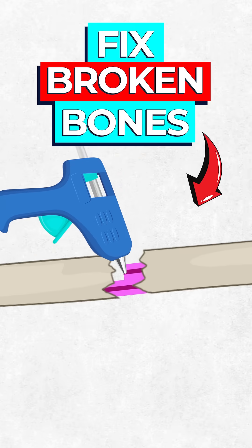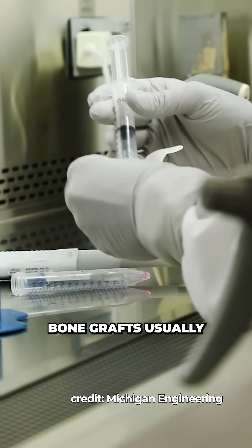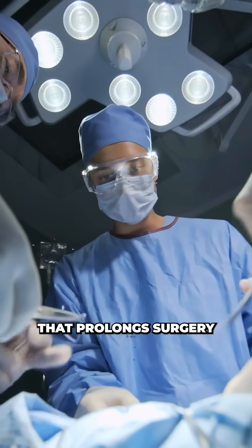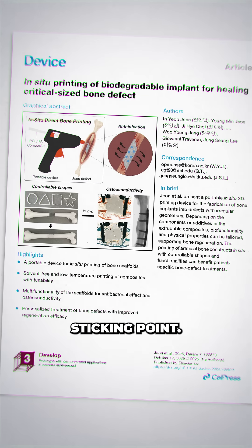Scientists just made a glue gun that can fix broken bones. No two fractures ever break the same way, which means that bone grafts usually require extensive planning and prefabrication that prolongs surgery and slows recovery. But researchers at MIT just developed a bone printing technology that could overcome this surgical sticking point.